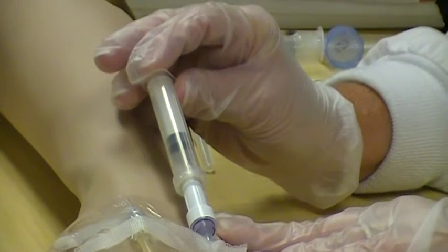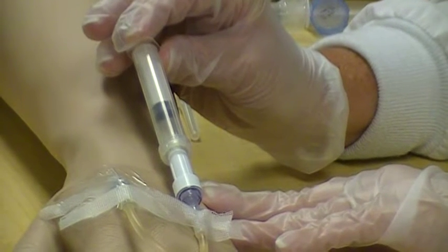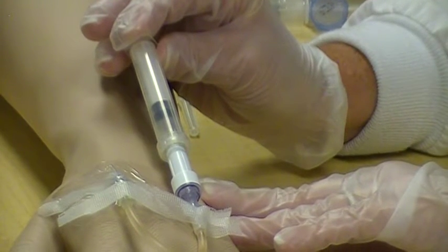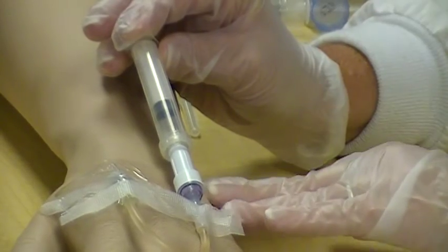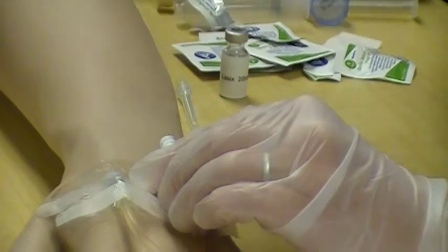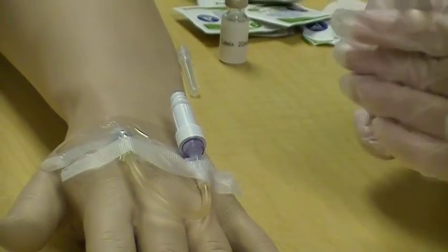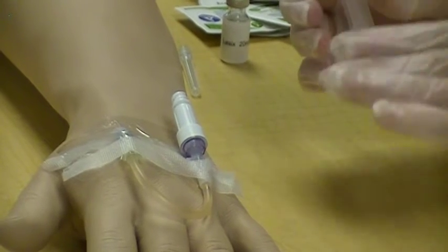So I'm watching my watch. I'm going to push it over the appropriate time. And again, for time purposes, we're going to say that it's been a full minute. I'm going to take it off. Okay. The next thing, we need to push some more saline into the saline lock.